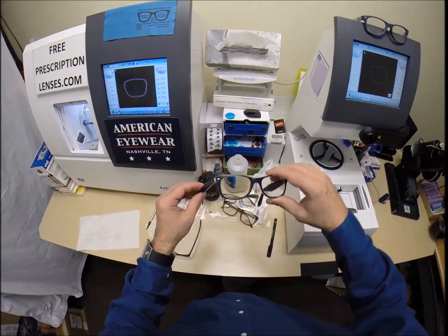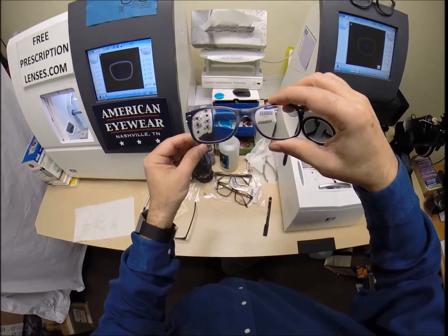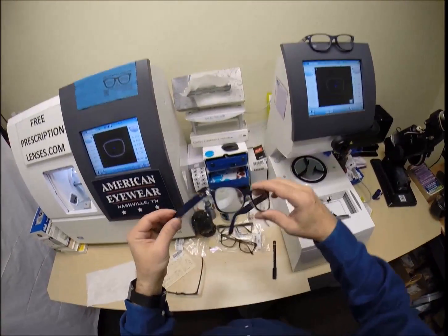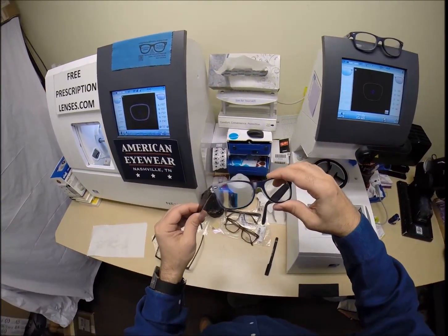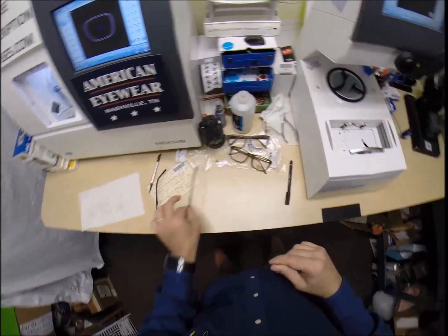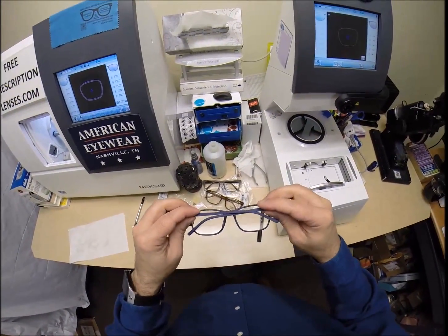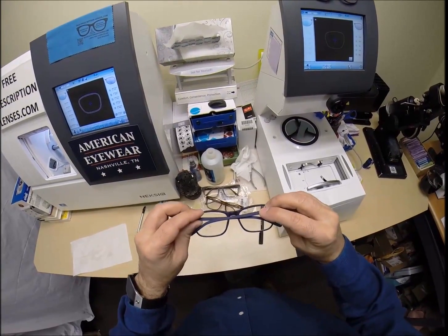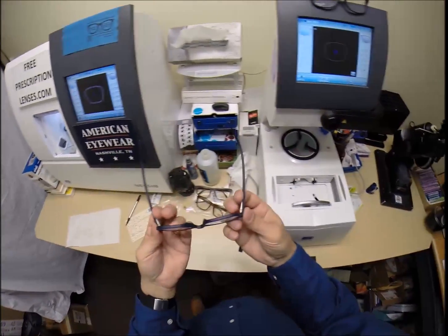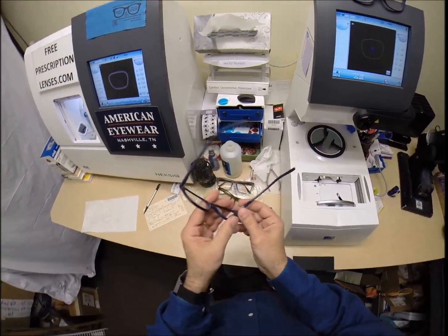For those of you keeping score at home, I'm wearing the Ray-Ban 2132 new Wayfarer sunglasses that I took the dark lenses out of and I put clear lenses in. Now I've transitioned lenses so when I go outside they look dark, but they're clear inside. Let me put mine back on so I can see what I'm doing. Flip these over, press down, there is no wobble. I close each temple to make sure they overlap perfectly, and they do, that neither temple is askew. Of course, these are quality made frames, you never have to worry about it. I check the tension on each spring hinge, those are good.